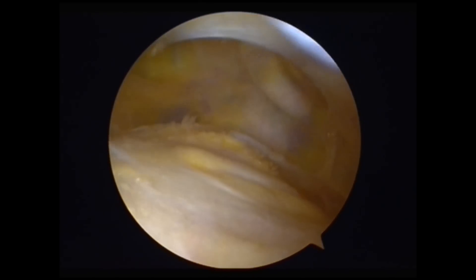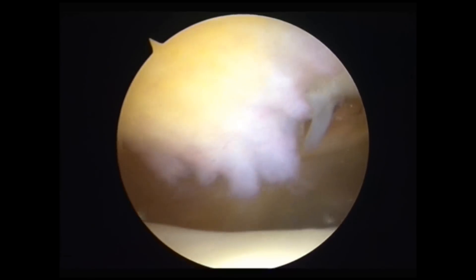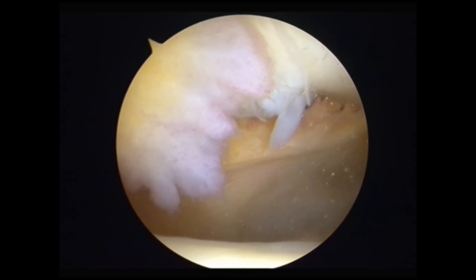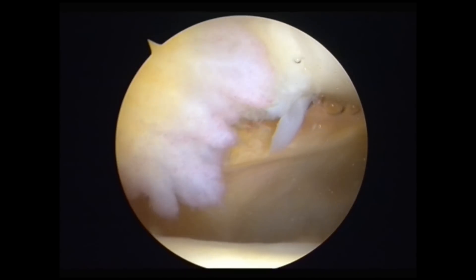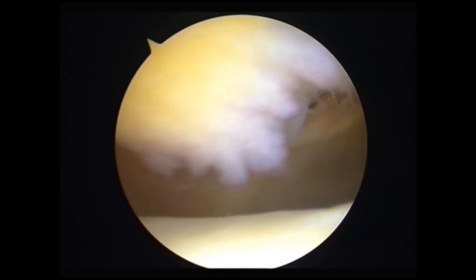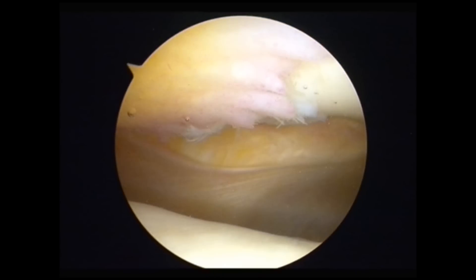That's a large suprapatellar plica there. As we come round on the medial side of this left knee, you can see the damage to the medial facet of the articular cartilage of the patella, and a large bit of Hoffa's fat pad impinging the joint. There I am pushing the fat pad to demonstrate how it impinges between the patella and the trochlea below.